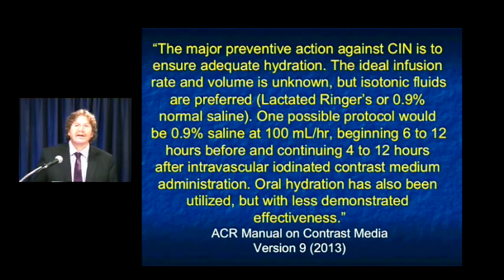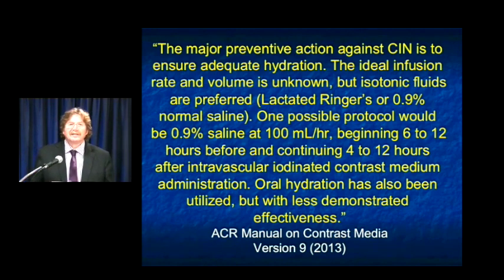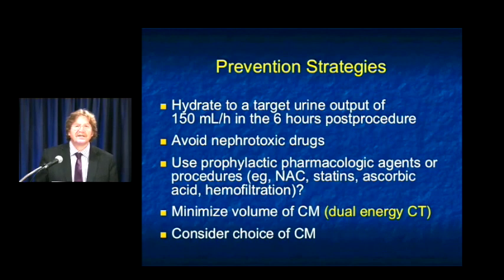Some people say in borderline patients, one thing to do is make sure the patients are adequately hydrated. We use water. Patients drink a lot of fluids. But if you really need to hydrate patients, one protocol that the ACR manual suggests would be 0.9% saline at 100 ml per hour, beginning 6 to 12 hours before and continuing for 4 to 12 hours after contrast. Now, the problem with that is, of course, you're talking basically about almost a full day. On a hospitalized patient, that is indeed possible. On an outpatient, it's not.